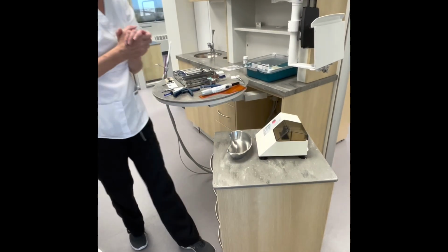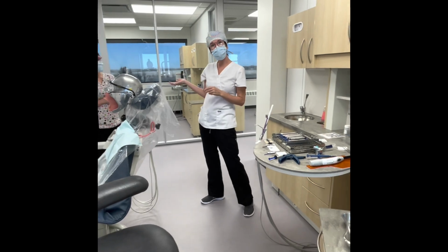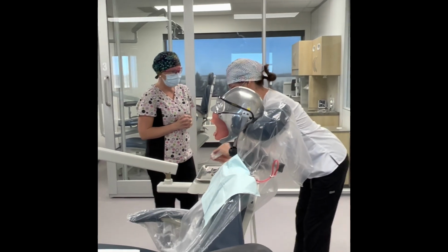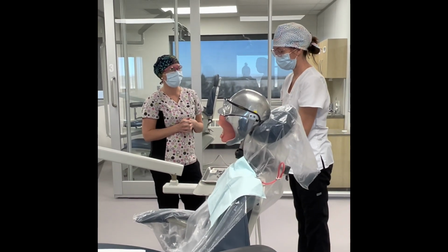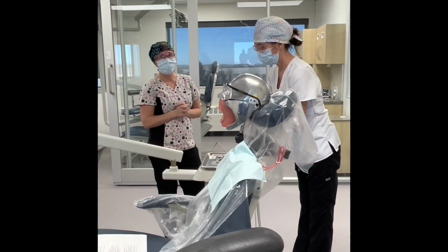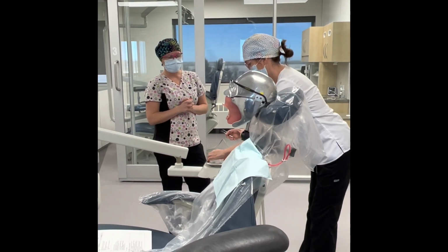All right. One thing that I'm going to do before we start is ask my operator, what burrs would you like in your hand pieces, Amanda? I would like a 330 burr, please. Okay. And a round low speed burr. Okay. Latch burr. So Stacy's going to remove those with the marked cotton pliers that are on the tray and place them into our hand pieces.